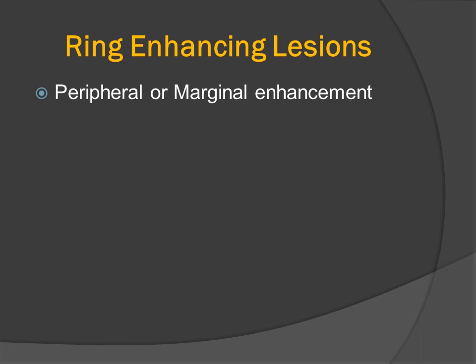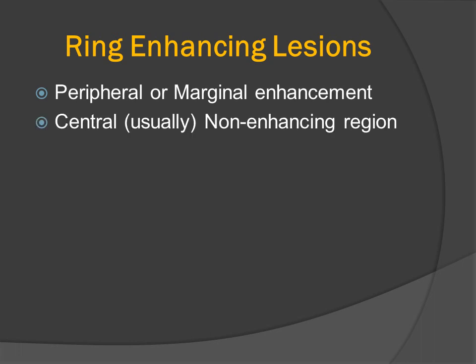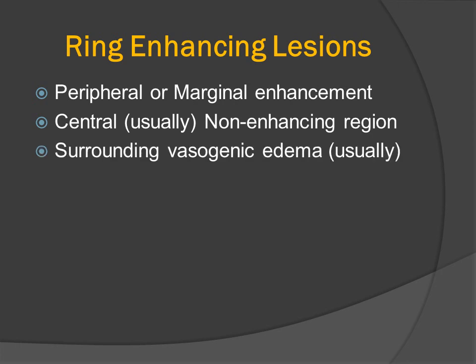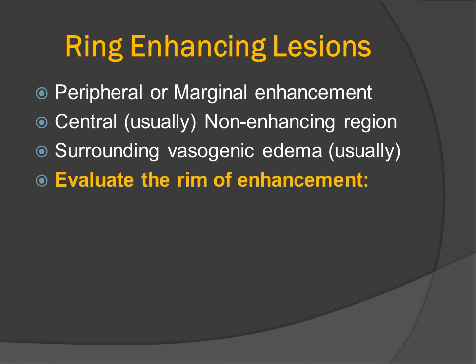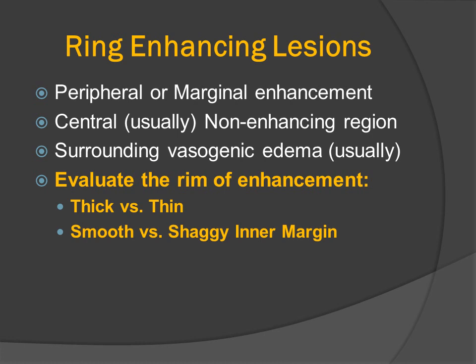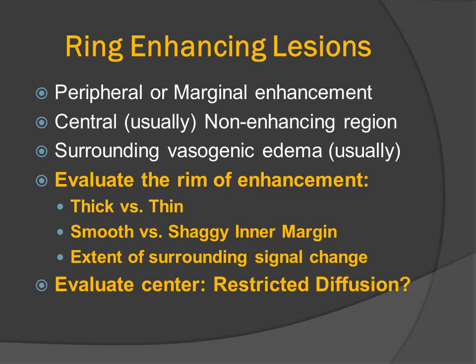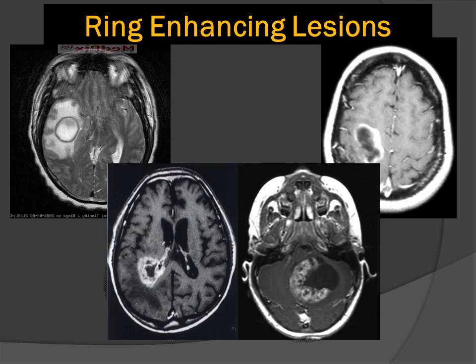A ring-enhancing lesion has peripheral or marginal enhancement that surrounds a usually central non-enhancing region. There is oftentimes surrounding vasogenic edema. We can evaluate the rim of enhancement to see if it is thick or thin, smooth versus a shaggy inner margin. We can look at the extent of surrounding signal change, often called vasogenic edema, and we can evaluate the center for possible restricted diffusion.